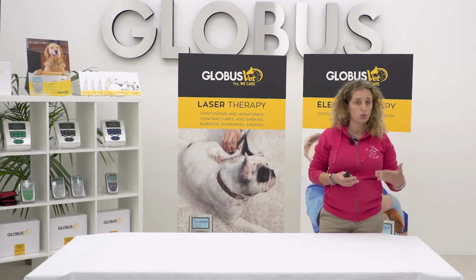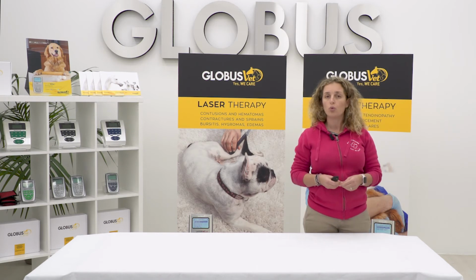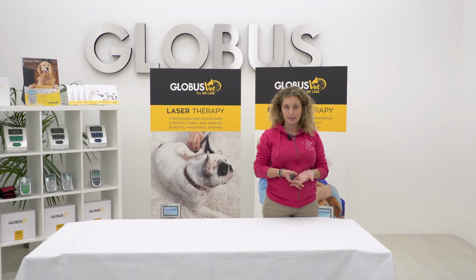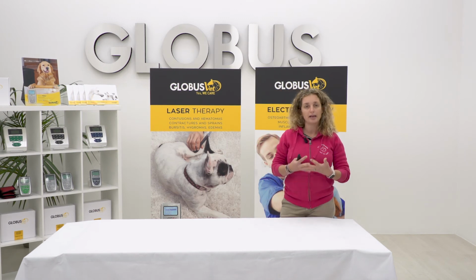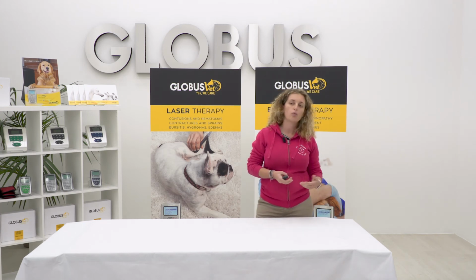However, the laser, in this case on the elbow, and also on the carpus, may be sufficient, because it helps to manage the problems and the inflammation at the cartilage level. It helps to stimulate the healing, and reduce at the same time the inflammation. To a lesser extent than TECAR, but enough to ensure the well-being of our patient.